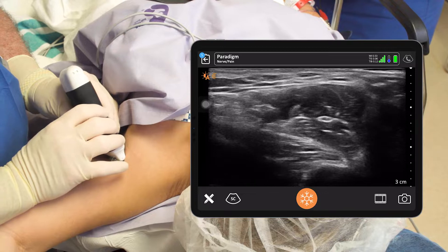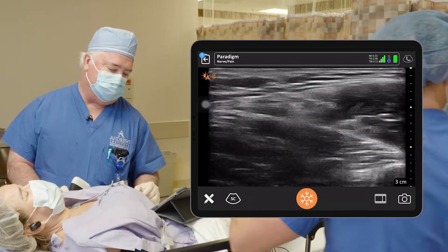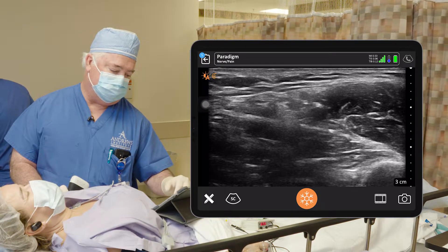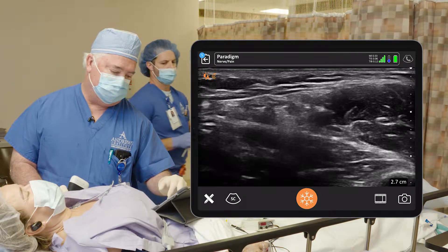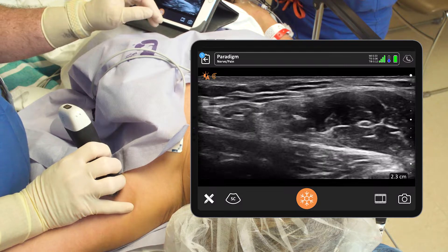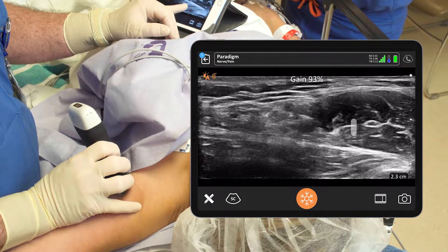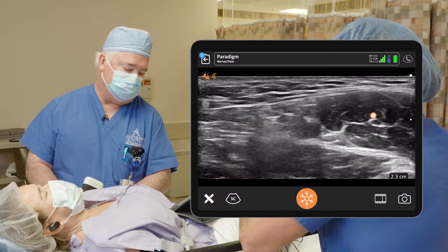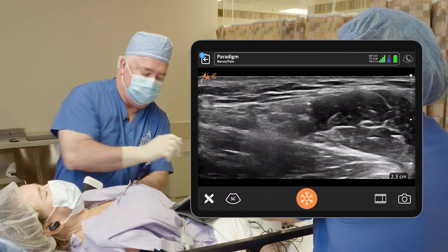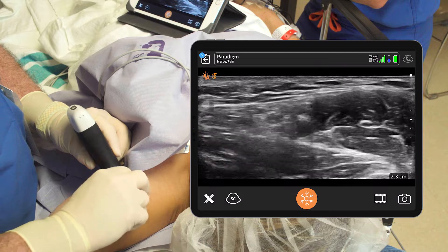I'm going to put the probe on and see what we've got. It's very superficial, so we're a little deep here — we've got three centimeters of depth. I'm going to decrease that a little bit. I decreased the depth down to 2.3 centimeters. You can see the artery right in the middle of the screen beating. I'm going to turn the gain up just a little bit so you can see what we've got going on here. I think that's the musculocutaneous kind of way out there. We're going to come in from the right side and work our way around the artery. I don't see the nerves really well, so we'll be looking for nerve stimulation to help us out.